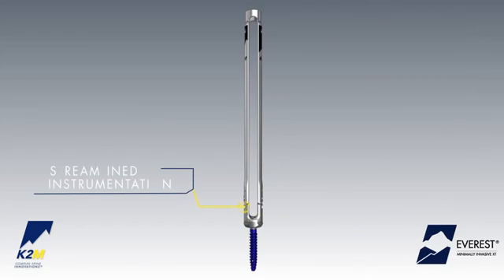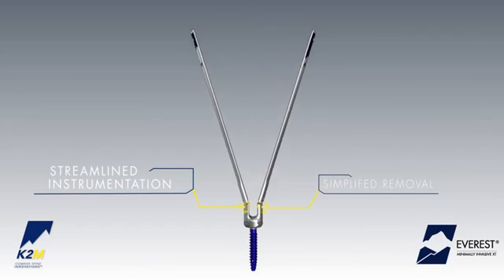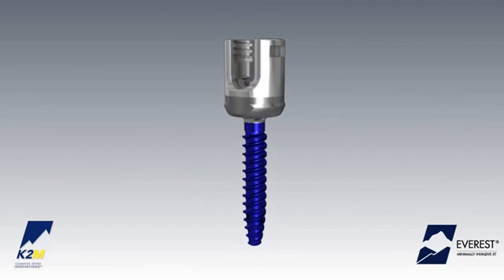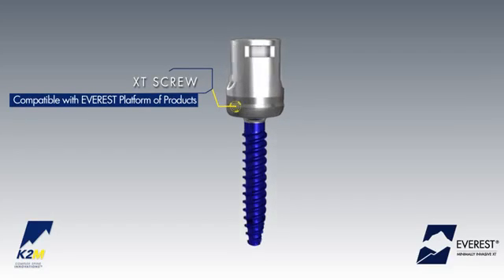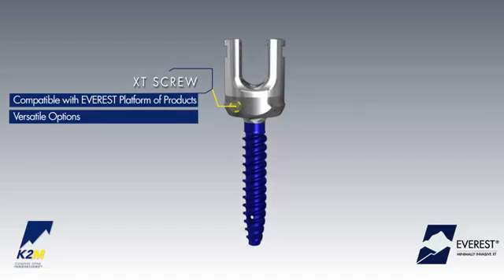Streamlined instrumentation allows for simplified extension tab removal after final locking of the construct. Upon removal of the extension tabs, the XT screw is compatible with all Everest system instrumentation, providing a versatile option for users.